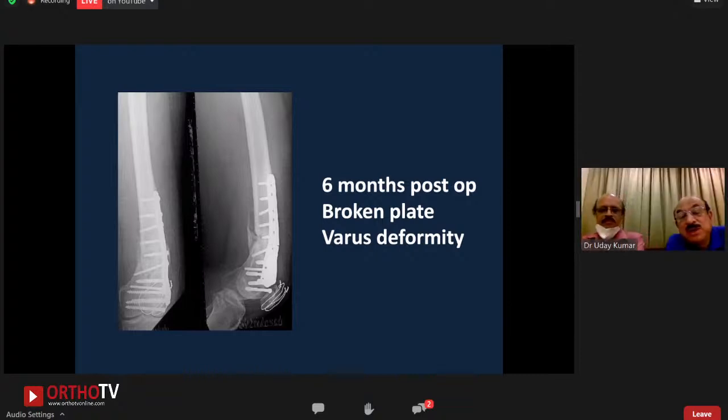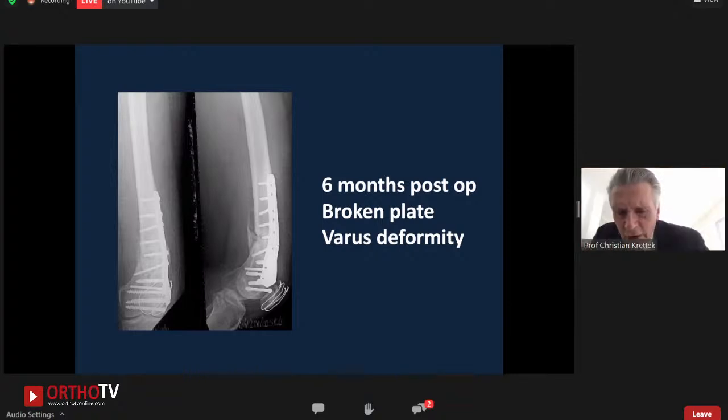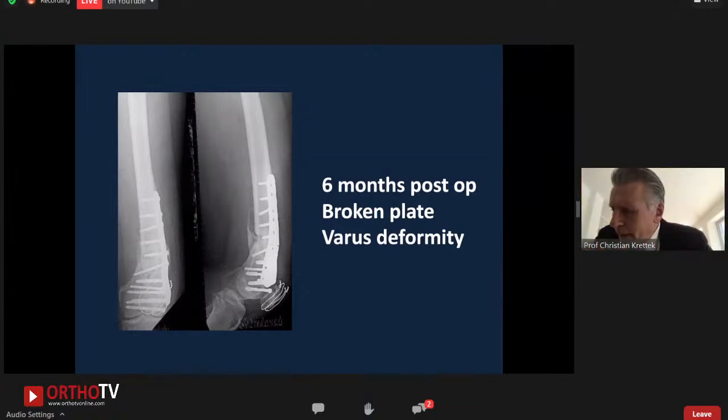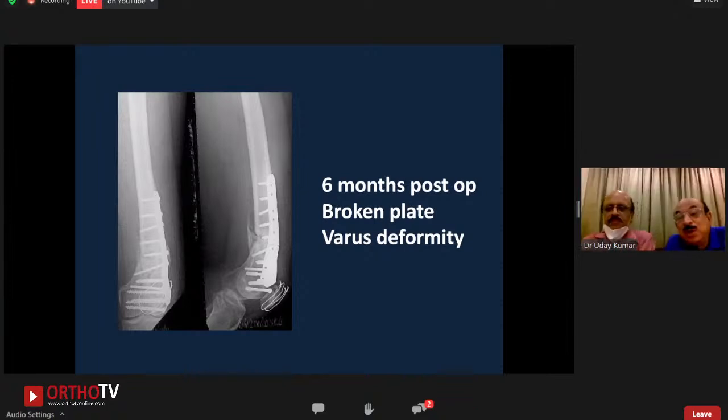What would be the implant of choice here, sir? I think there's nothing wrong with the implant. We probably would take the same implant or a straight 4.5 millimeter LCDCP. We would use the plate tensioning device. The old Muller's clamps? Sorry? Old Muller's tensioning devices, sir, we used to use. Yes. Okay. Can I proceed? Sir, 1 minute.